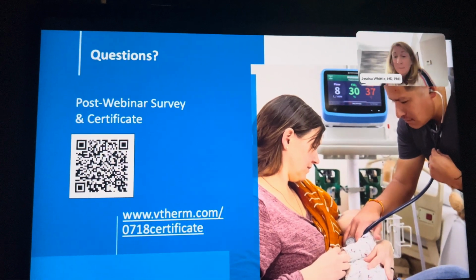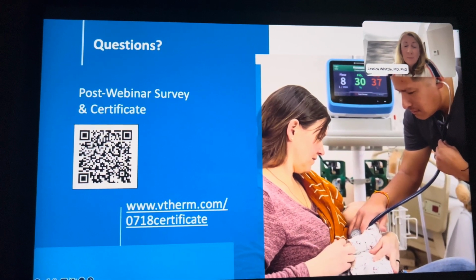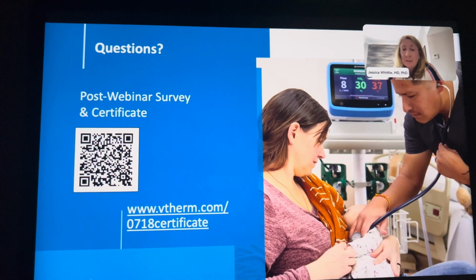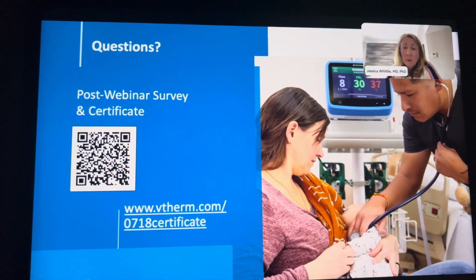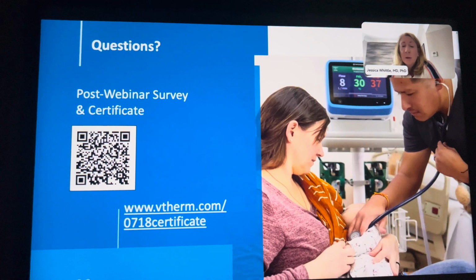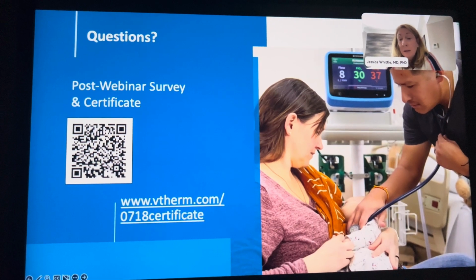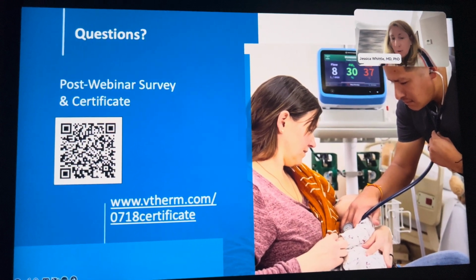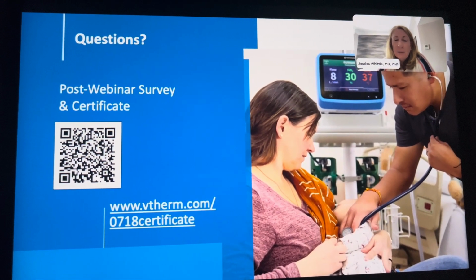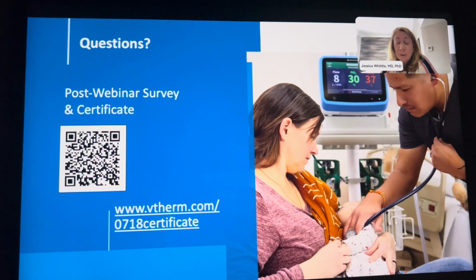Awesome. That was a really great point that you just made, Dr. McQueen. I'd just like to highlight it. You said titrate their flow based on work of breathing. So in my practice, I titrate FiO2 by oxygen saturation. I titrate my flow for work of breathing or hypercapnia. And so I think it's really important to recognize we should titrate those independently. In an optimal patient, a type 2 respiratory failure, I bring down the oxygen as quickly as I can for all the obvious reasons about oxygen toxicity. And then consider weaning the flow. But even in a small child, oxygen saturations, FiO2 for work of breathing, or excuse me, flow rates for work of breathing.